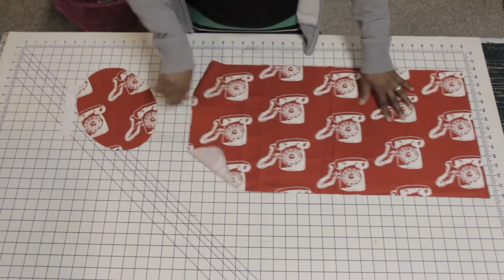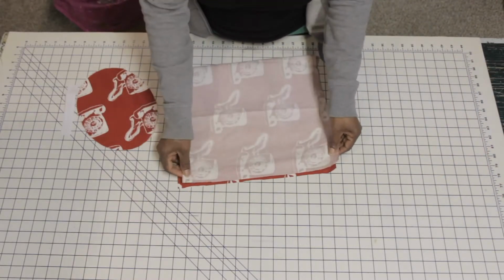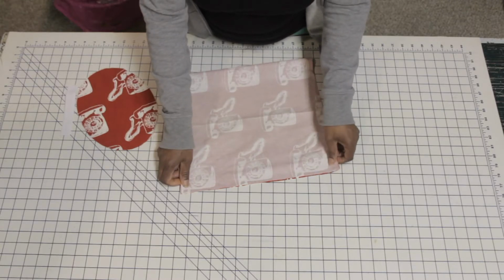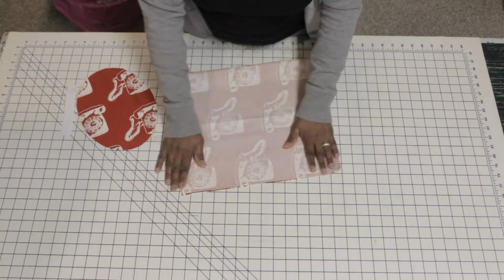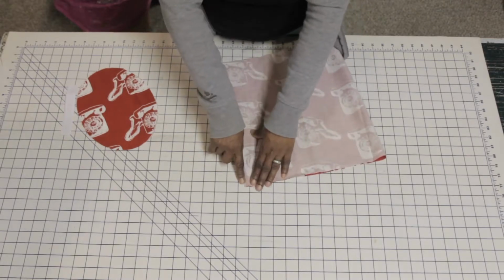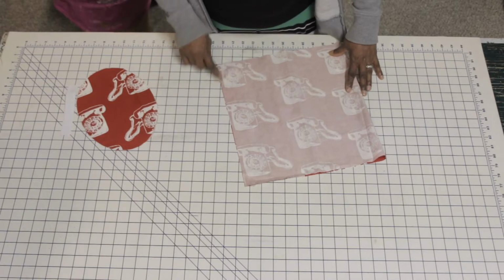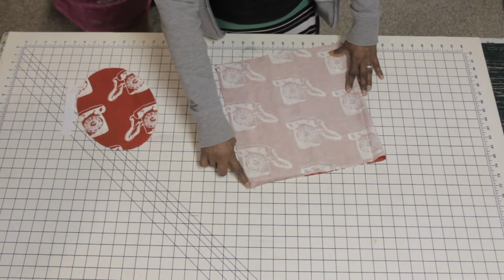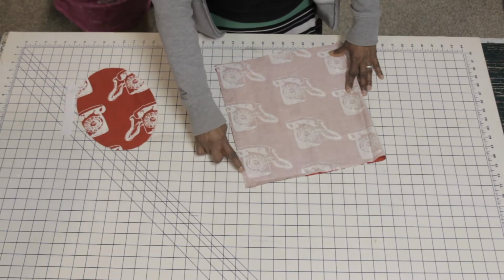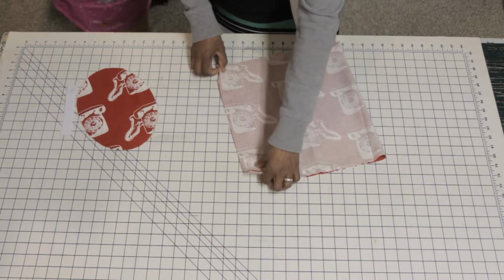So what we're going to do first is fold this in half so that the short ends are right sides together. If you need to pin it, you can do so, and we're going to sew a 1/4 inch seam. This seam right here, 1/4 inch. You're going to again back tack, a short back tack here, a few stitches. So let's go to the machine.